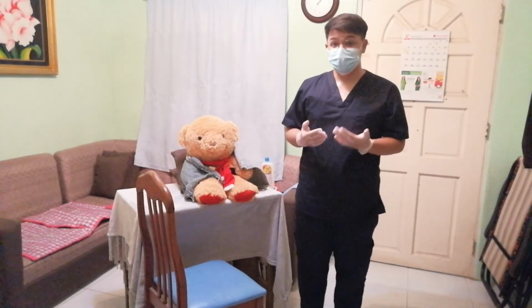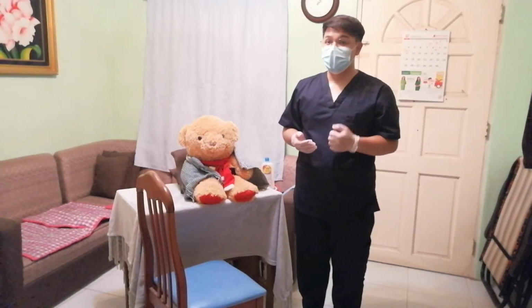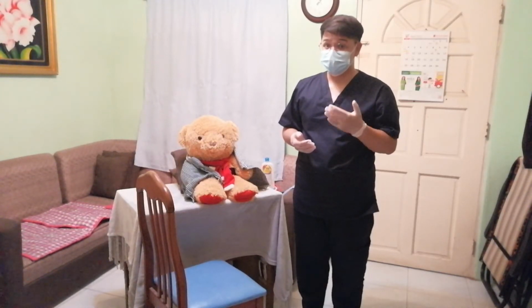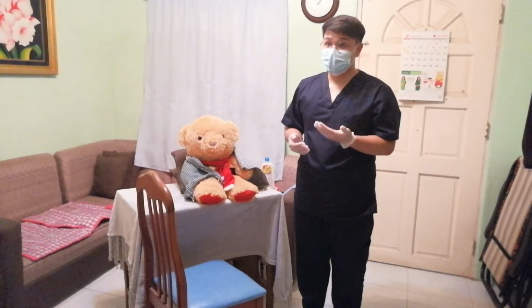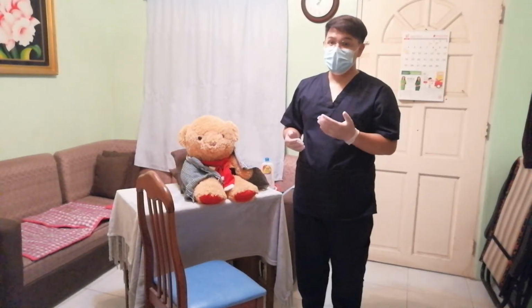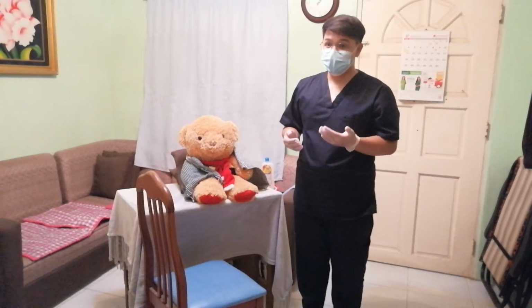So for our 15th step, we need to encourage again our patient to make use of the stand assist device, and if necessary, the second nurse or the second staff should grasp the gait belt on the opposite side, and we need to use the gait belt to assist the patient to stand.